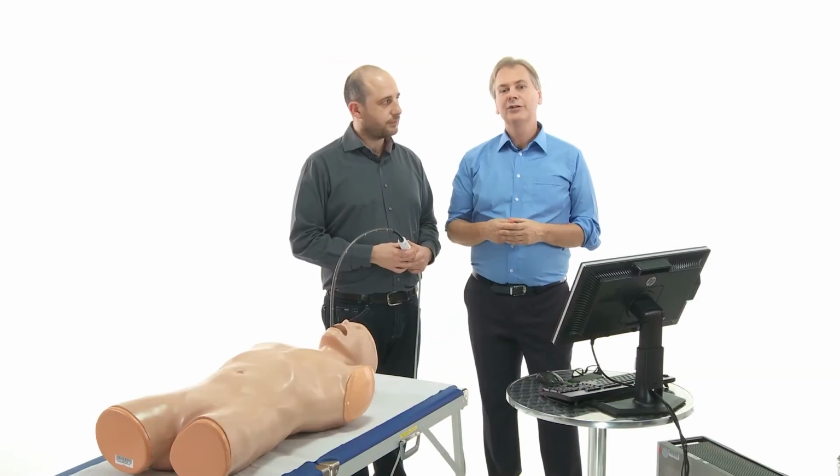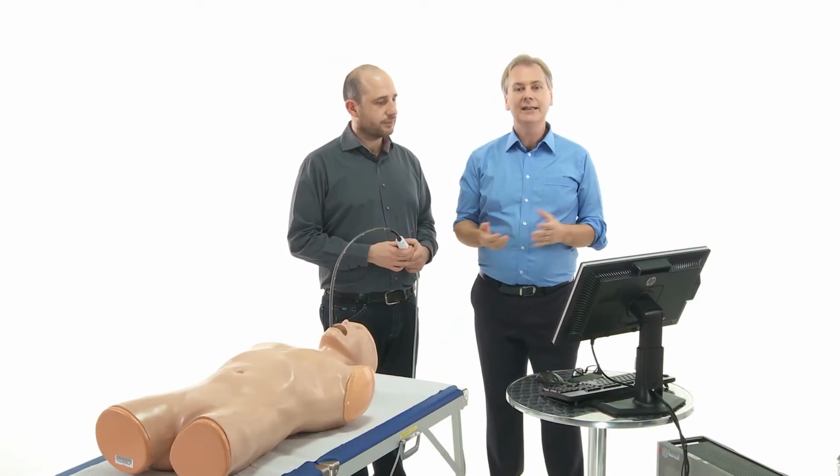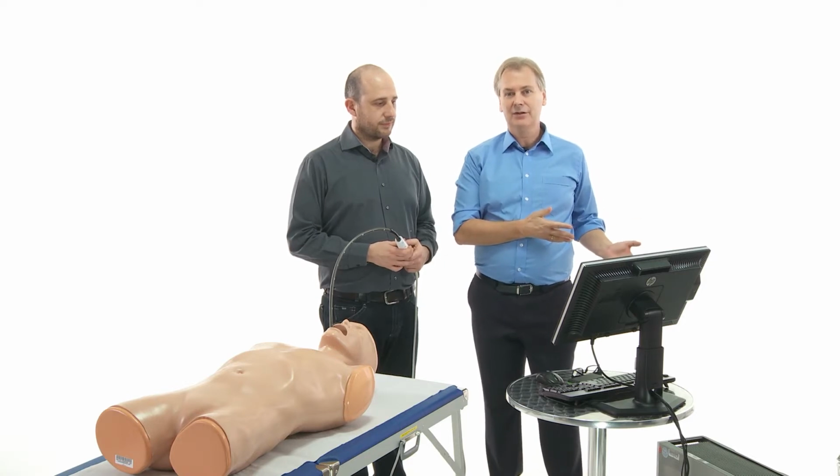We're not done yet because Bruno still has an important view for you. In most patients with aortic stenosis, you will not need TEE. You can easily quantify it with transthoracic echo. But there sometimes are situations where TEE is mandatory, where you have to use it.